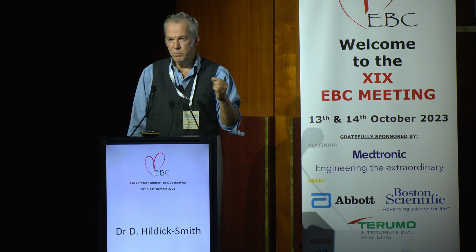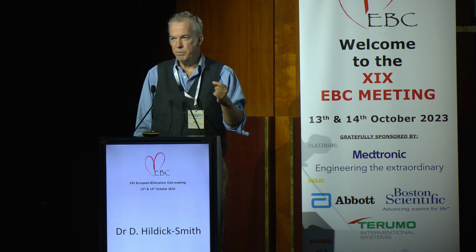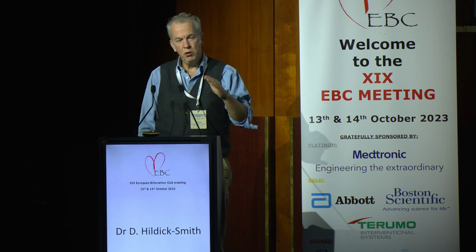And as I say, once you put the stent in, you can't take it out. It's a permanent inflammatory nidus. Okay, for 99% of people, maybe it's okay per year, but for 1% it isn't.